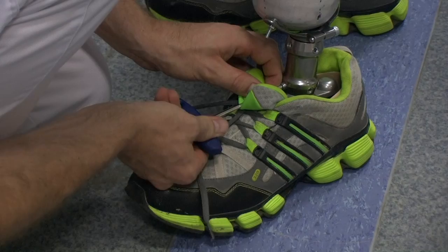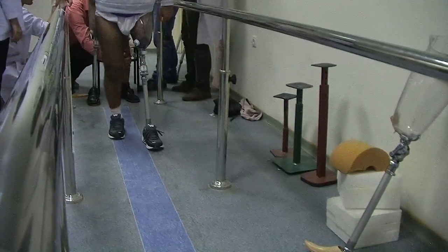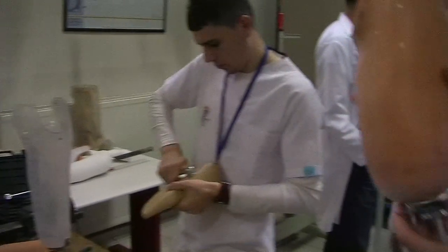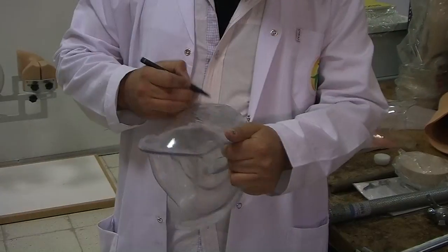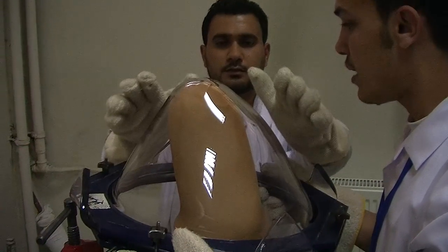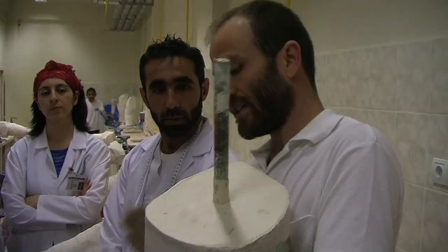The first thing we are going to ask is whether the patient feels comfortable while walking. We should also check the step length — if both steps are the same length. The goal is always to minimize mistakes: be systematic, be organized, be structured, be honest, and be critical with yourself. A good professional is critical with themselves.